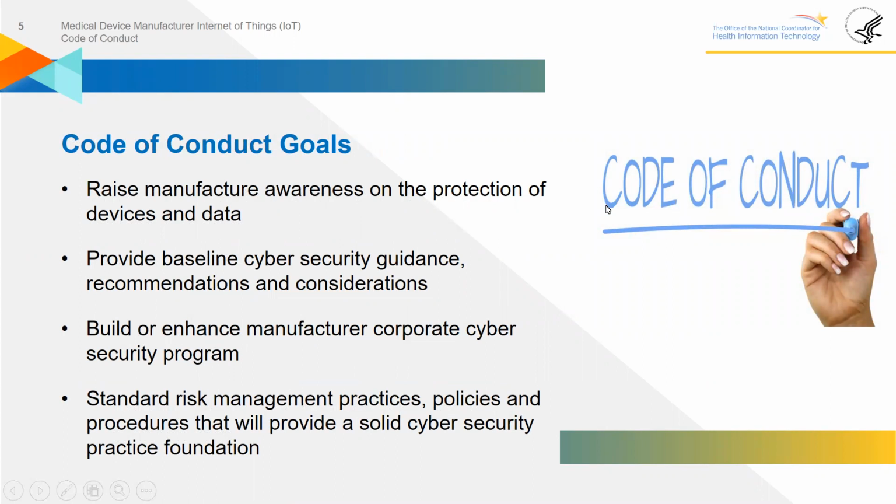The Code of Conduct goals. It is the workstream's desire to, one, raise awareness, to help manufacturer awareness on how they can affect and improve the protection of medical devices, the data, and patient safety by incorporating technical safeguards. For example, security features within their devices during the design phase of their product, meaning building it in on the front end instead of considering cybersecurity on the back end.